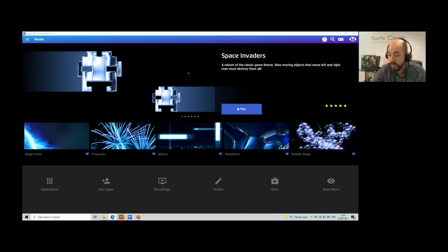There's also then the gaze menu. So if I was to click on the gaze menu, that automatically accesses it for the eye gaze user. So once we open it up as that, it'll stay as that until we exit out of that particular mode. If we exit out of the game, or off the software, it's automatically going to open up that way on the software when we open it up again. So if we have just activated for the gaze person, for the user themselves, automatically when we open up the software again, it will go back to gaze menu for us.